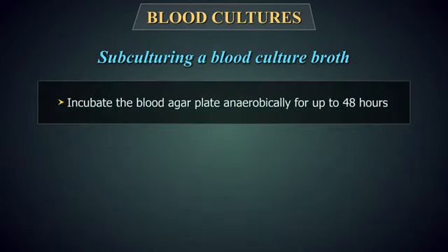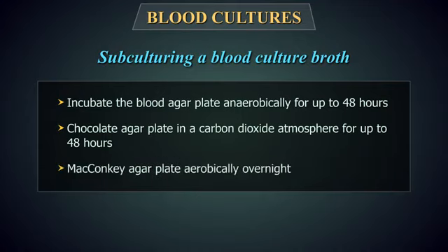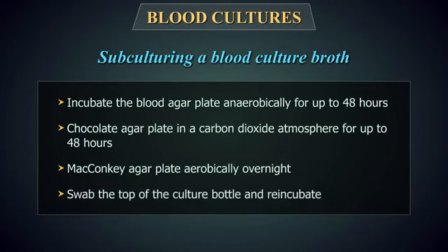Incubate the blood agar plate anaerobically for up to 48 hours, the chocolate agar plate in a carbon dioxide atmosphere for up to 48 hours, and the MacConkey agar plate aerobically overnight. Swab the top of the culture bottle and re-incubate.